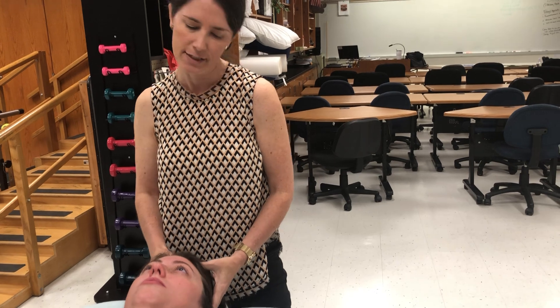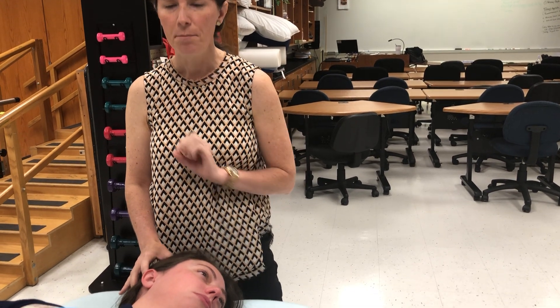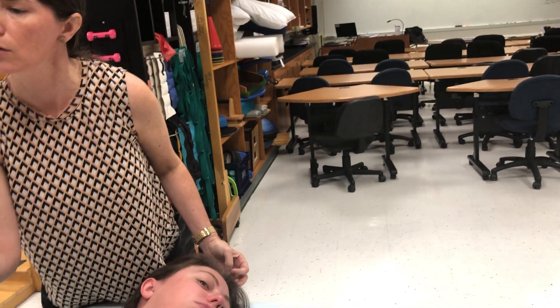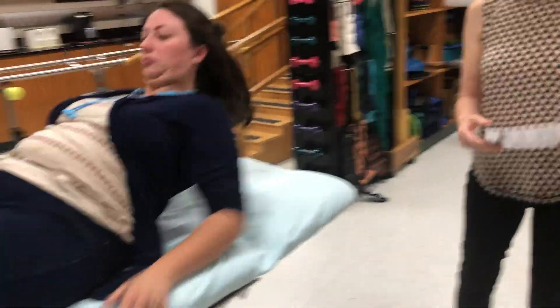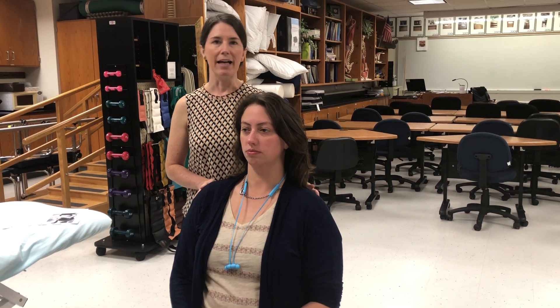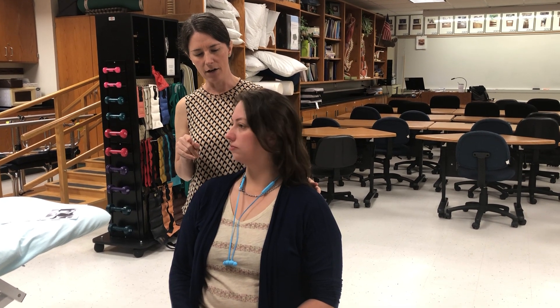If she was only able to come up through a partial range, we would call that a grade 2. But there's another way to test for a grade 2 — I'm going to have you come back to this wooden chair. A grade 2 is either partial range against gravity or full range gravity eliminated. So if we have the patient back in a sitting position and she rotates her cervical spine, that's rotation gravity eliminated. Turn your head toward me as far as you can — and then back to the center. That's a grade 2 for right rotation because she went through her full available range gravity eliminated. And then to the left, and then back to the center.